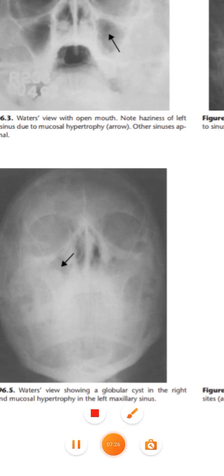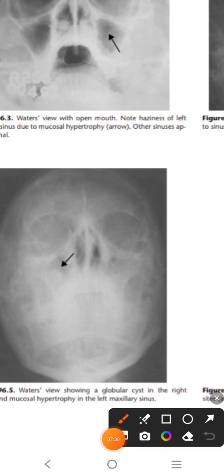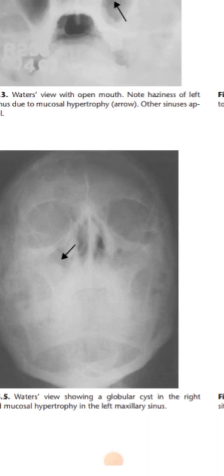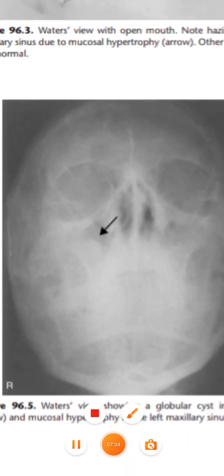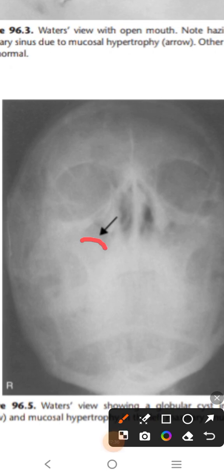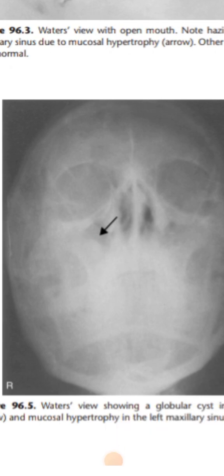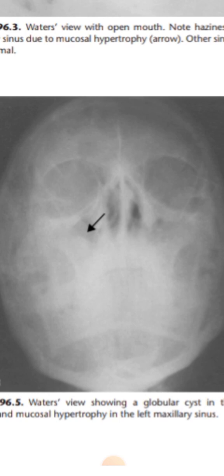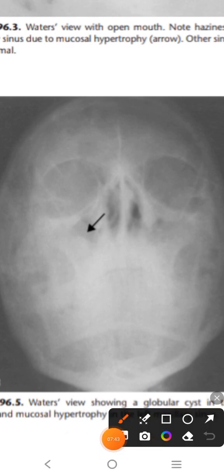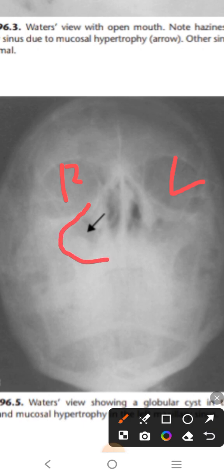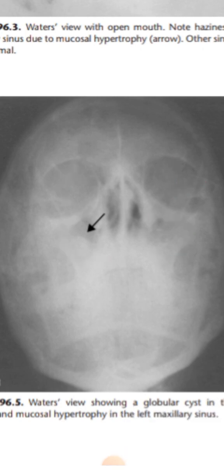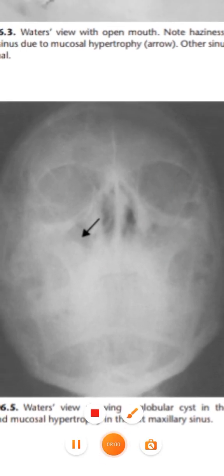Here is another Water's view - not very clear but you can see a dome-shaped structure, which is mainly a globular cyst. On the left maxillary sinus side, while not clearly visible, you can compare the outlining and appreciate some hypertrophy. So there is hypertrophy of the left maxillary sinus, which you can easily appreciate by comparing the two sides.